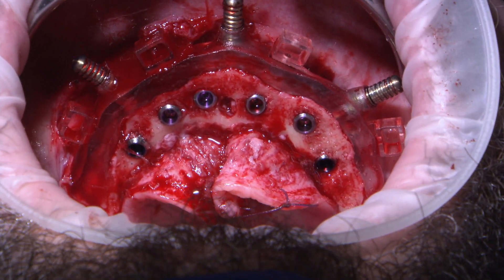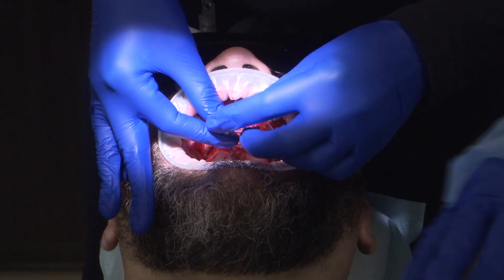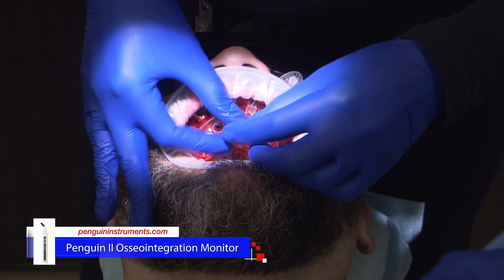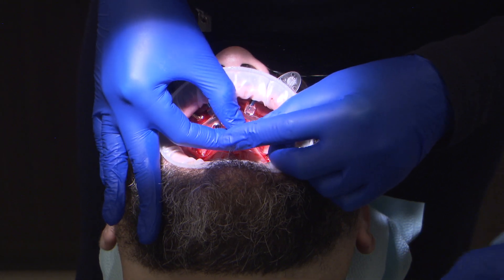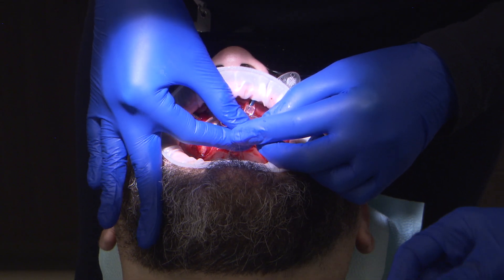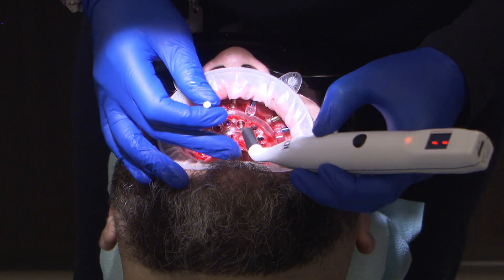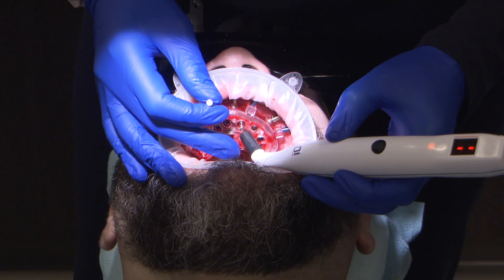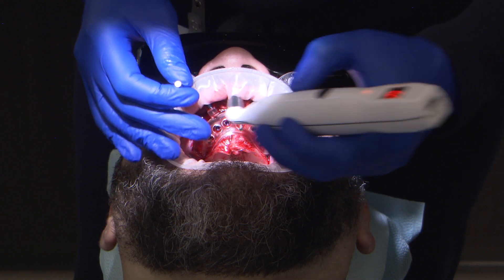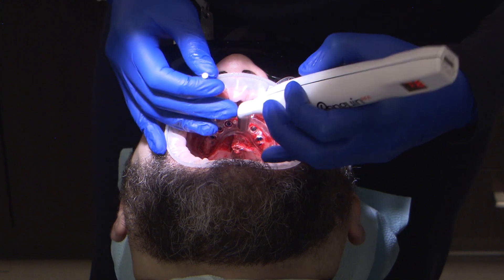The implant stability quotient, or ISQ value, was calculated using the Penguin II Osteointegration Monitor. The acceptable stability range for cross-arch immediate loading with a provisional implant prosthesis is a measurement between 55 and 85. Ideally, I prefer to achieve at least a value in the mid to upper 60s when immediate loading cross-arch implant restorations. For single unit restorations, I do not load a restoration lower than a value of 70.